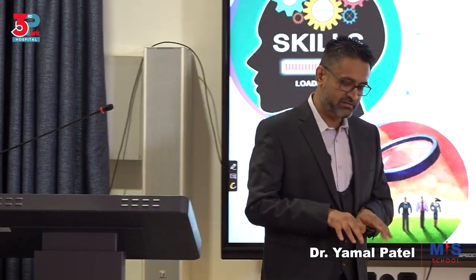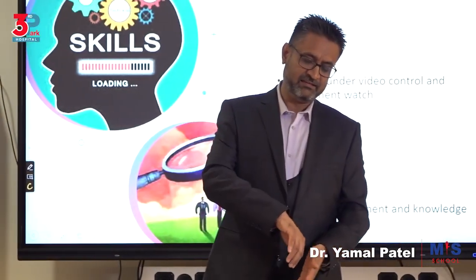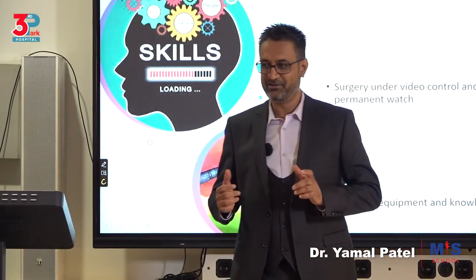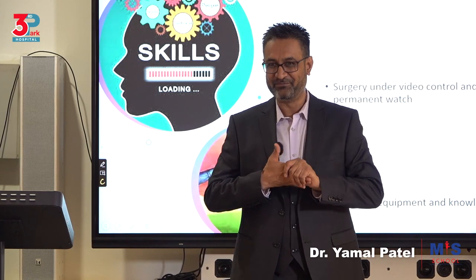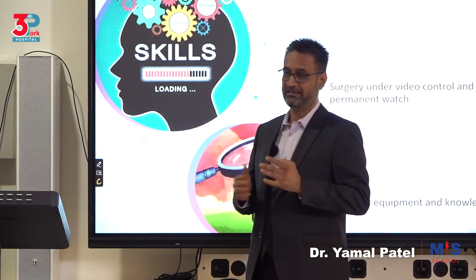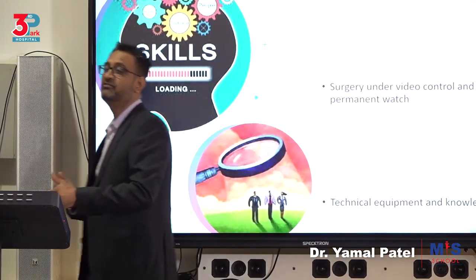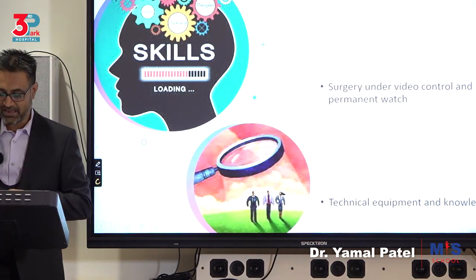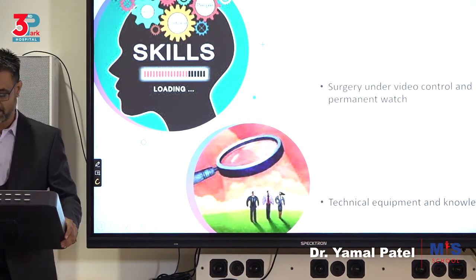When you're doing your own surgery in an open case, there's adhesions, you'll put your hand and you'll separate it and be like, okay, done. We can't do that anymore in laparoscopic surgery. Everybody in the theater is watching you. Everybody who is recording is going to watch you on exactly what you're doing. So you have to remember that now I'm under watch. So do things the right way. There are no shortcuts in MIS.